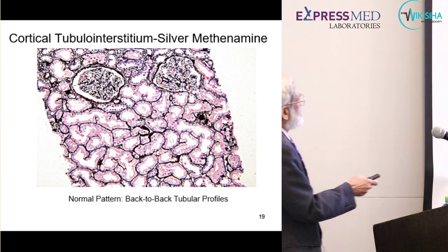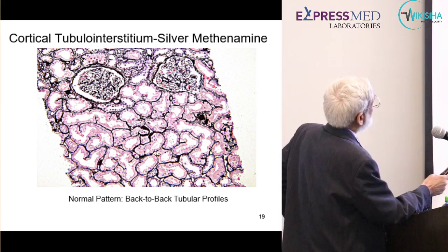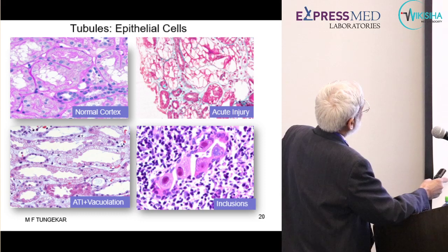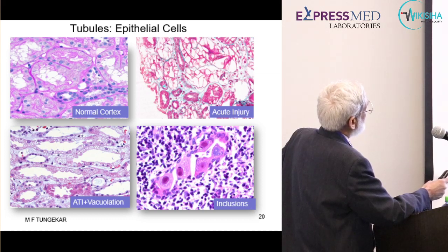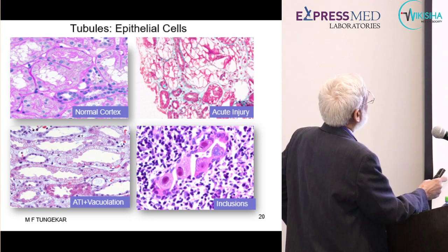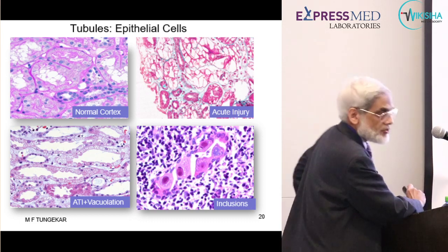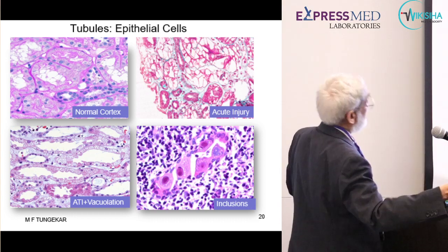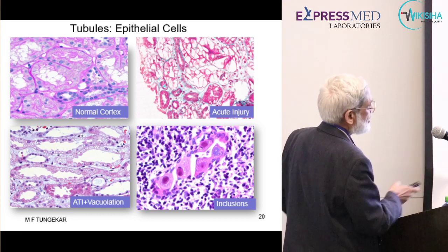Look at the tubular epithelial cells. In the normal cortex, you see proximal and distal tubules. And how do you differentiate? See these tubular epithelial cells. They have a brush border on the PAS stain. The best thing to look for is the brush border. Electron microscopically, these will be microvilli. If you count the number of cells there, 1, 2, 4, 5, 6, 12, but only 4, maybe 5 nuclei are seen. That's because the cell cytoplasm has a huge volume, a big cell, so that each section doesn't necessarily pass through the nucleus.